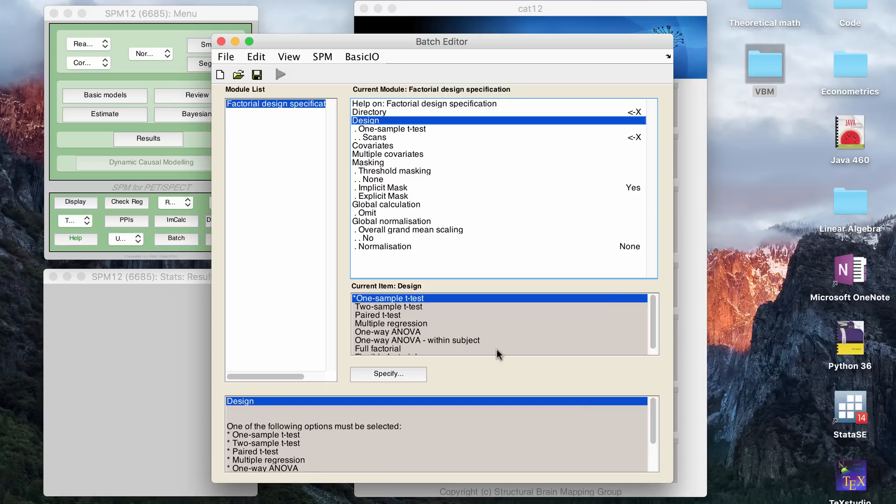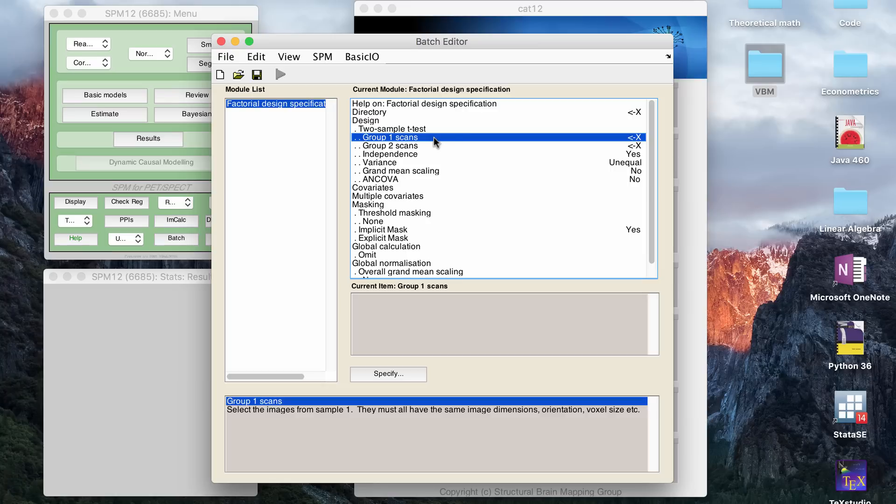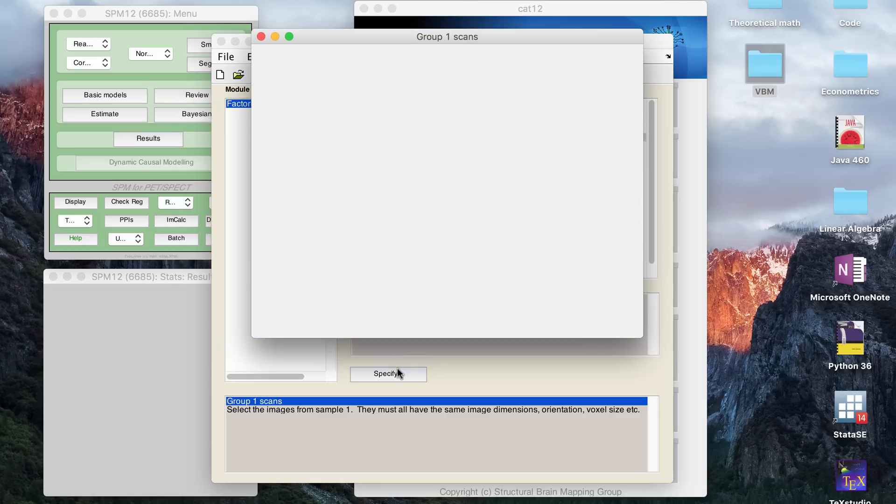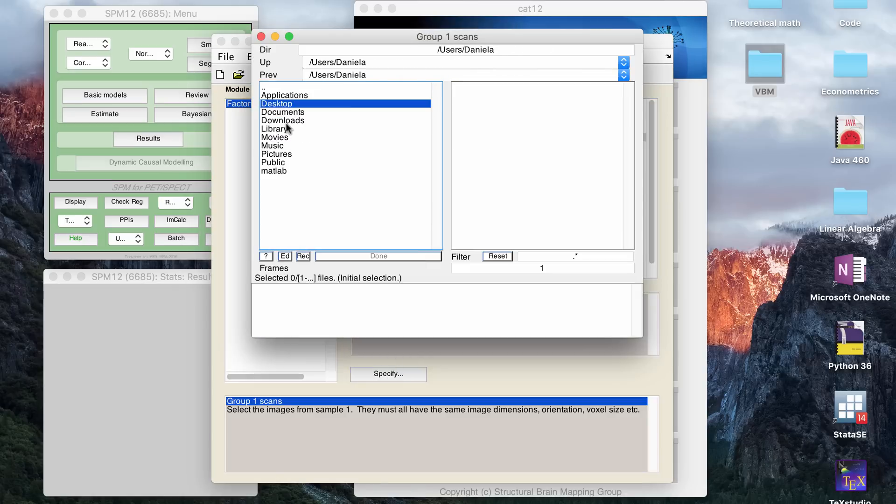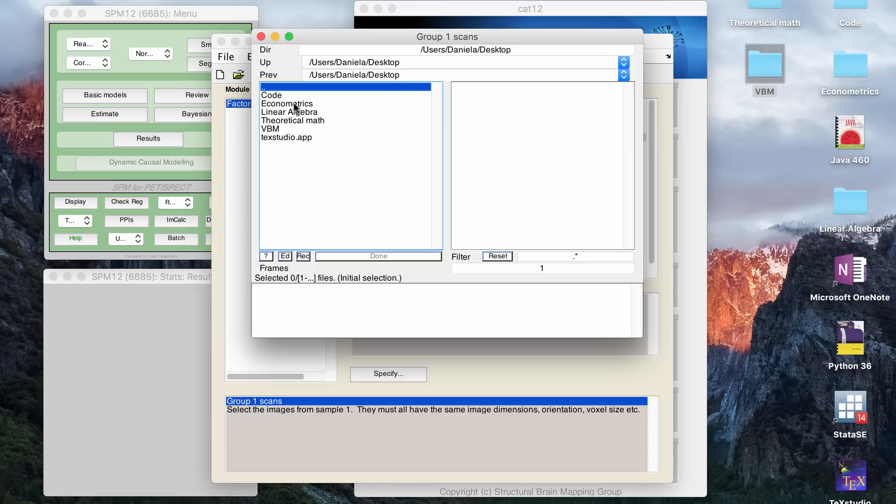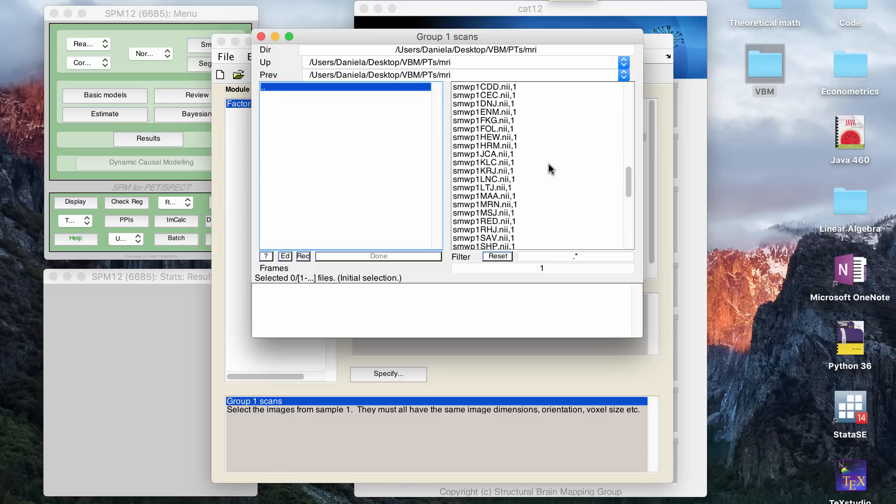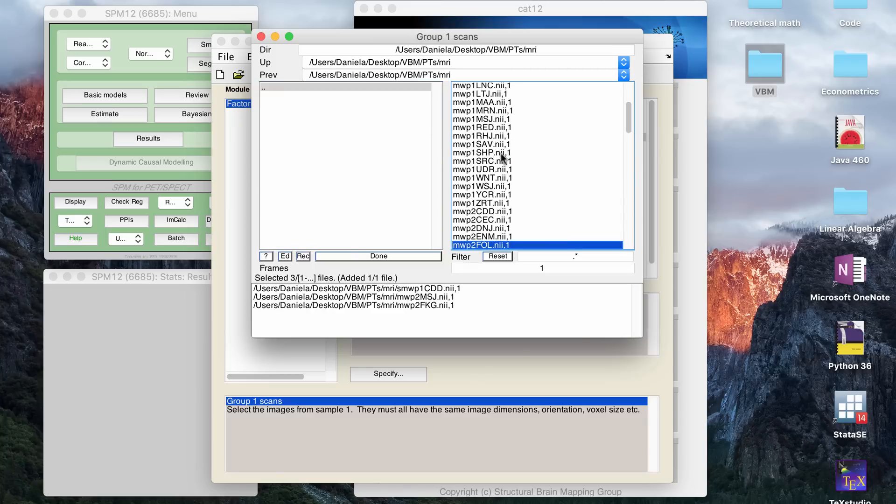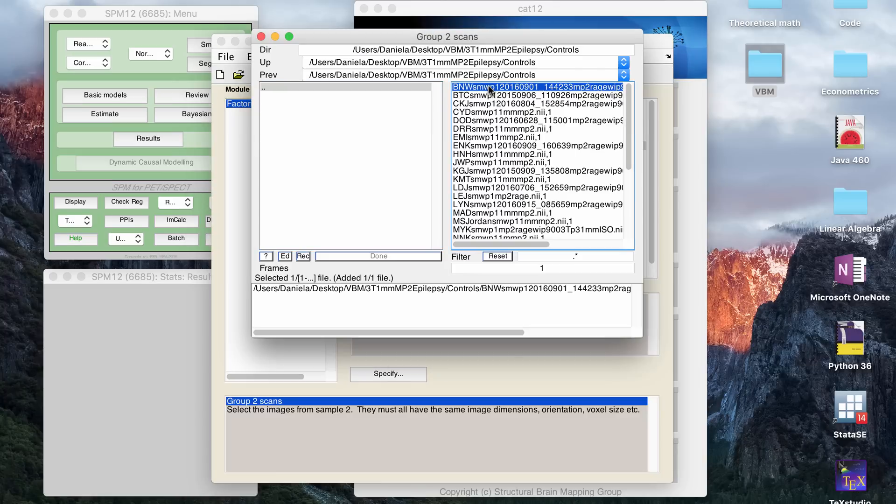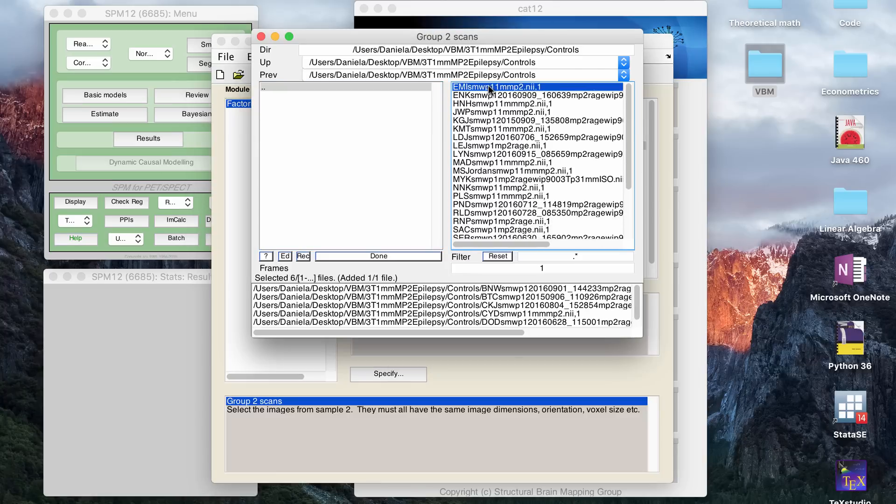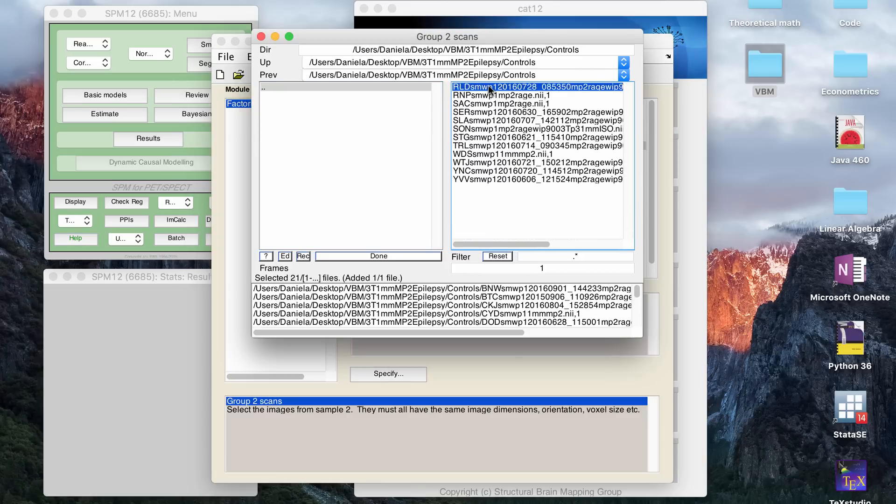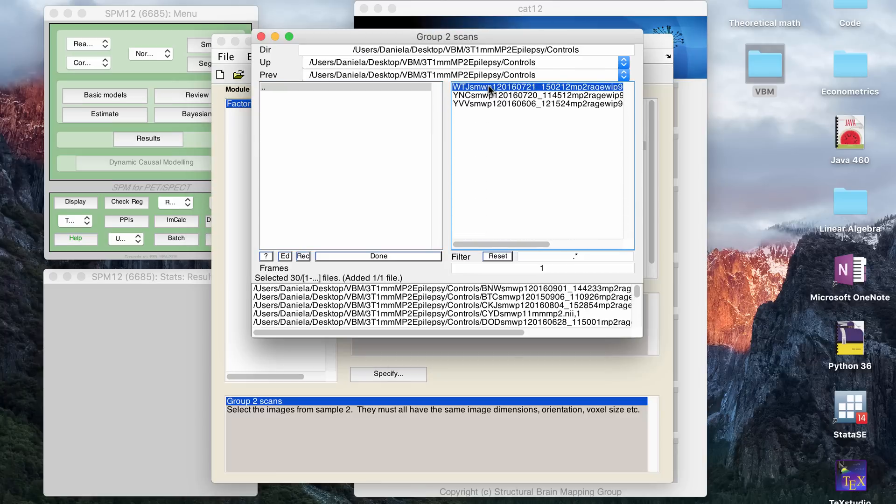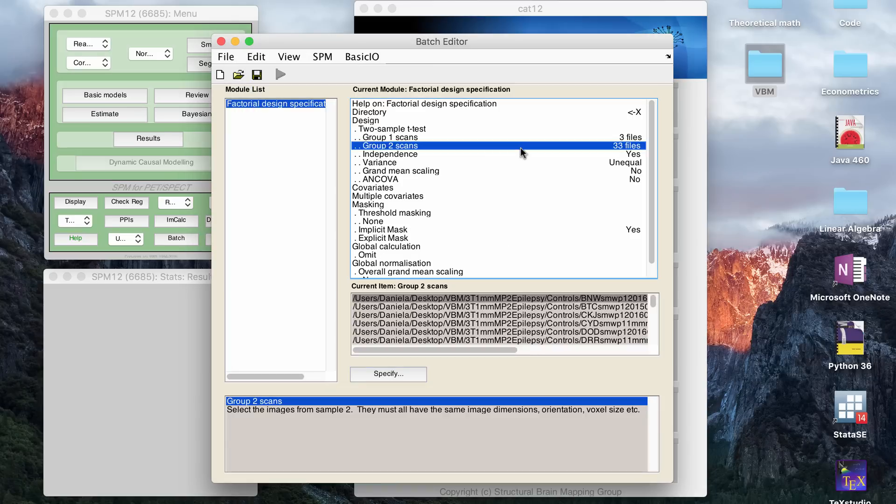Then for design, like I was just saying, you want to pick your design. So for me, I always do two sample t-test. Then I would put one file here. So if you have a patient group and a control group, then in your group ones, you want to put in all the files that were your smoothing files. So let me just pretend that I'm going to do it. So if I go to desktop, VBM, patients, MRI, then I'm going to put in all my smoothing files. It tells me I have three files. Then I have a control folder where I have all my controls. So I click all the smooth gray matter for my controls.